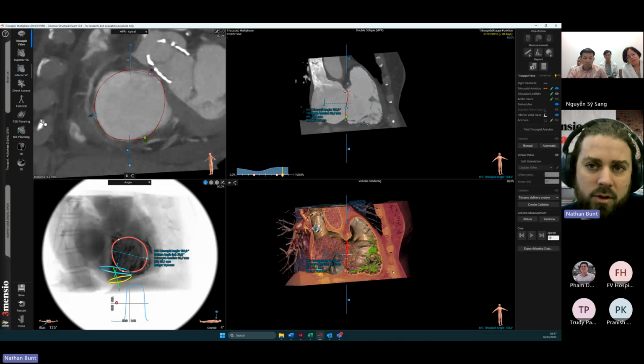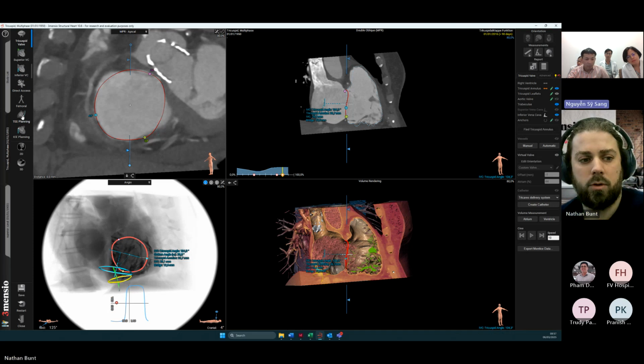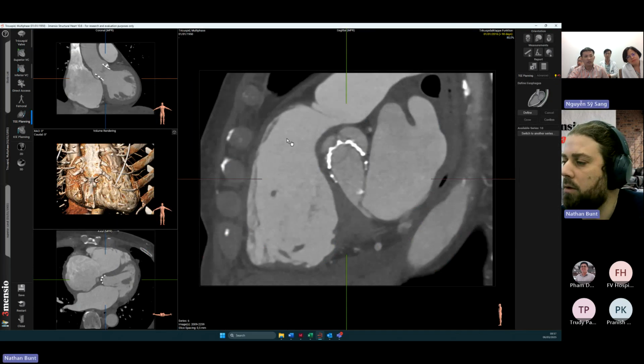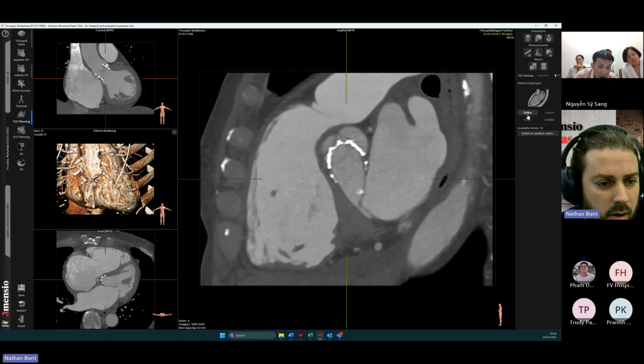Would you also like me to go over the echo planning functionality? Yeah. TE only? Okay. Sorry, I couldn't hear you there.